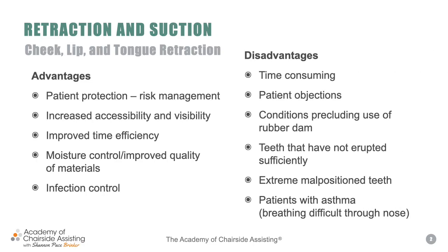We also want to make sure that we're not the reason we're taking more time. Our job as a dental assistant is to make the doctor's procedures more efficient and less time consuming. Again, the number one job of the dental assistant is to make sure that we're taking good care of the patient, and we never want a patient to complain about us. So when you're a new assistant, the most important thing to do is to keep the patient's mouth clean and, most importantly, free of any debris.